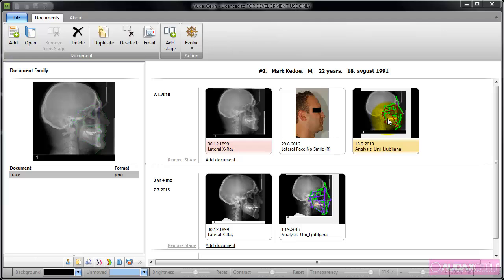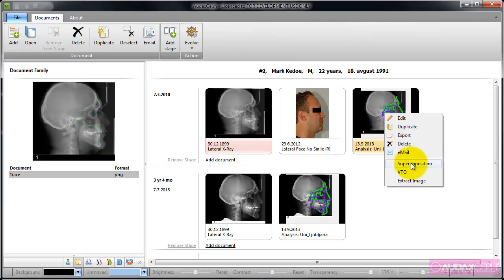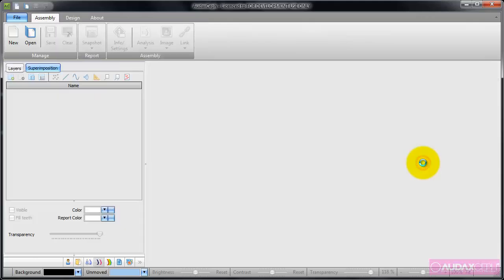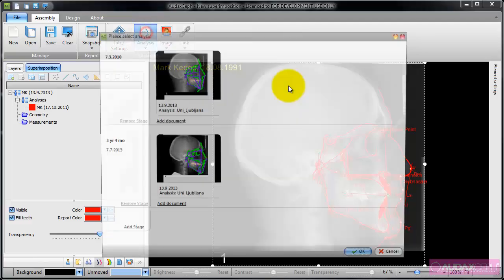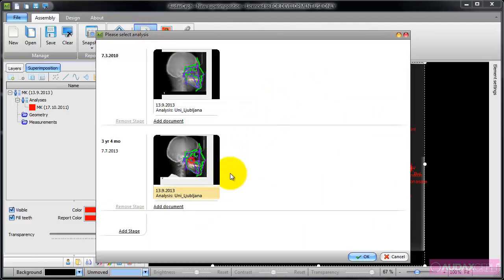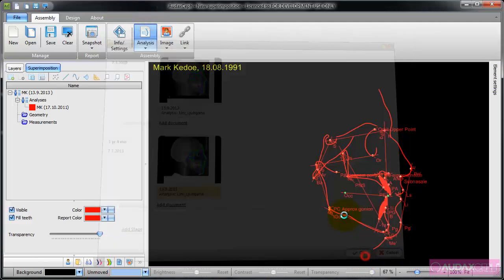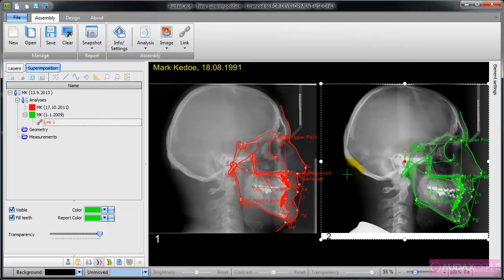To manually create a superimposition, I open the first analysis in the superimposition environment. Then I add the second analysis, and now I have to create one or more links.